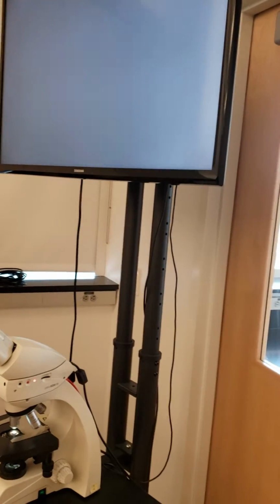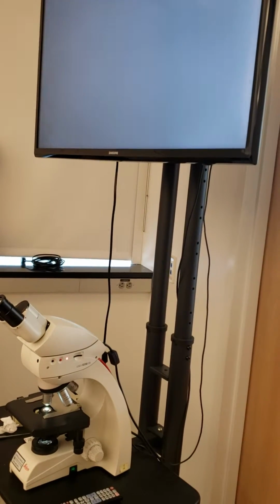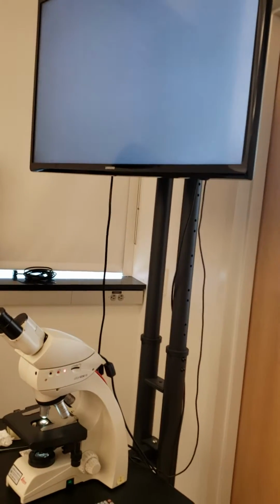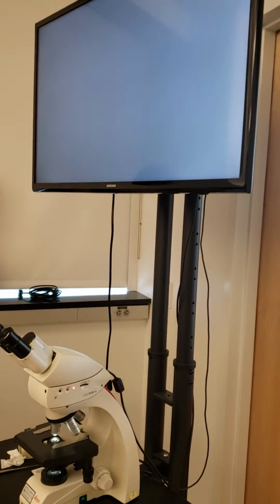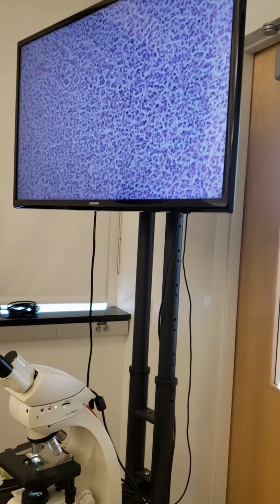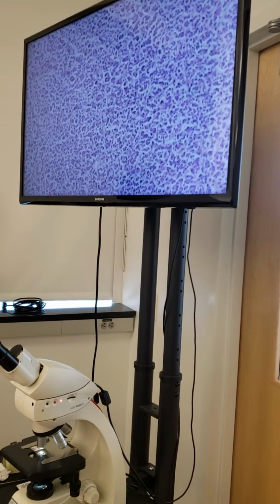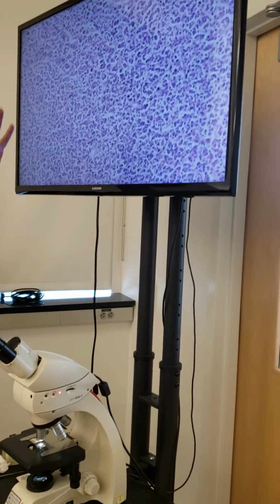And the next one is Pituitary gland. This is number 1, slide number 1. And it says here, hypophysis. But hypophysis is the other name for pituitary. Pituitary. No, this is pituitary, but can you identify whether it is anterior or posterior? Yes, you can, because anterior is loaded with cells. This is full of cells, right?